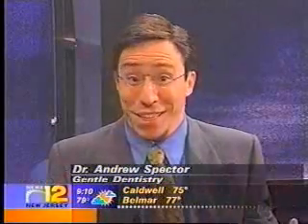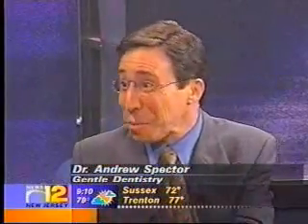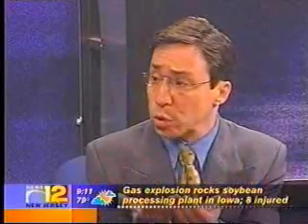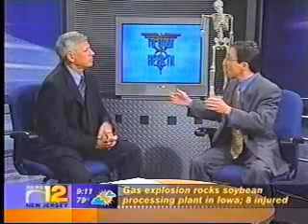Well, talking about crowns today. First of all, let's tell people, what are crowns? Some people have never heard of it. When a tooth is broken down to such a point that a filling won't work anymore, it's a large filling. Those big gray ones in the back, and you get that broken tooth, that classic dental emergency. Typically over the years, what was done is a crown or a cap. The cap surrounds the whole tooth and holds the tooth together, rather than asking the tooth to hold in a filling.